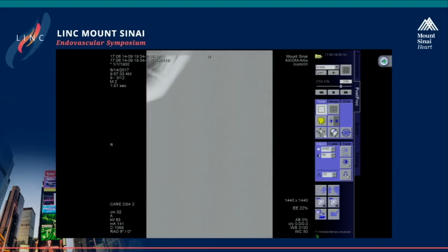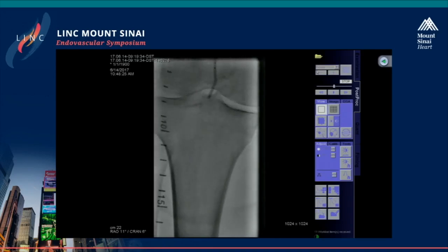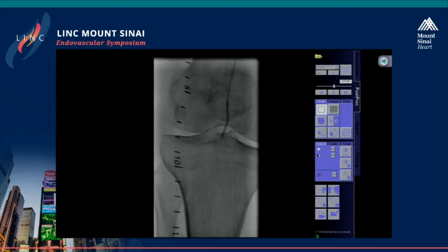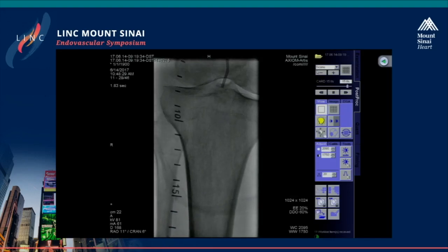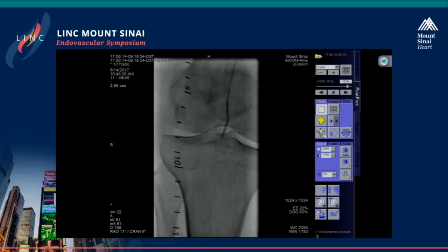At this stage, angiographically, we didn't see much calcium, and I just want to show you on the fluoroscopy. As you can see, there is really not much calcium. I can just take a picture here to show you. It's very, very smooth, and I've just got that catheter parked in the cap. So at this stage, our wire choice, at least here, algorithmically, is we just go with a hydrophilic type wire. Could be anything.